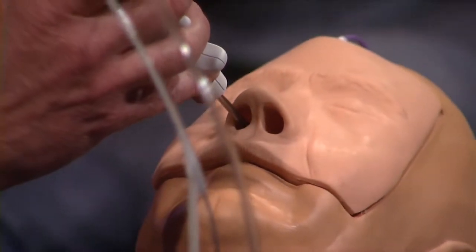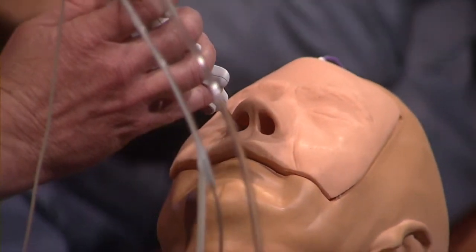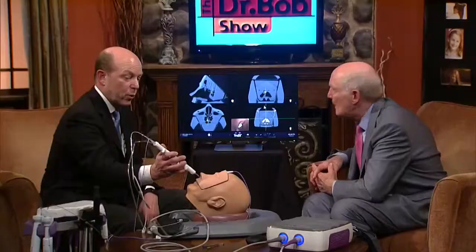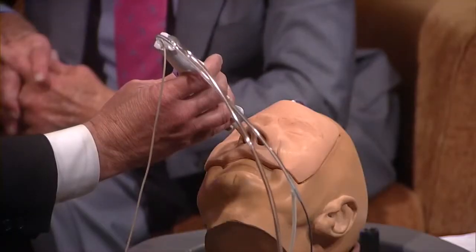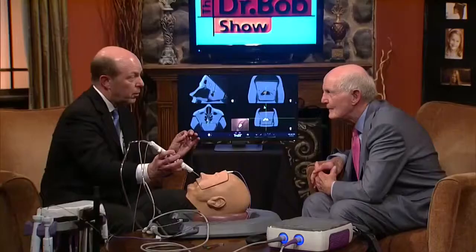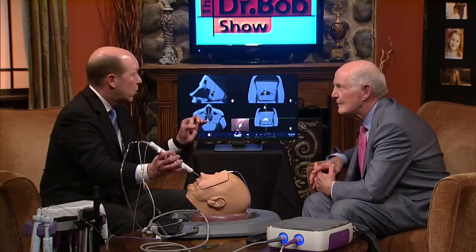So now you're ready to do the opening. You're ready to put the balloon in to dilate up the blocked hole. Correct. So now that the wire is in the sinus cavity, we'll pass the balloon with another sliding piece of equipment over the wire into the sinus cavity. Then your assistant will inflate the balloon. It's a certain size, and it will dilate the opening of the sinus. And then we take the balloon down, deflate it. You don't leave the balloon in there. Nope, it goes home with me. So you dilate up the balloon, then you deflate it, pull it out, and what has it done in there? It's opened the sinus cavity. So what was once obstructed is now open.